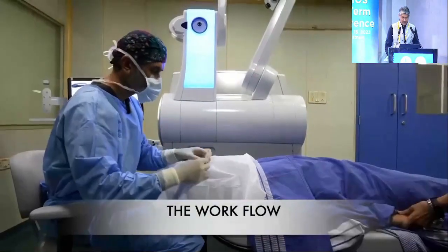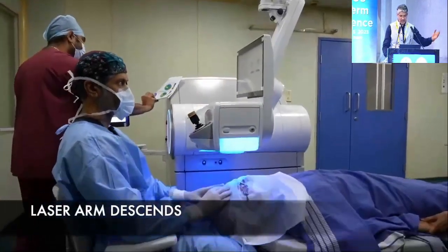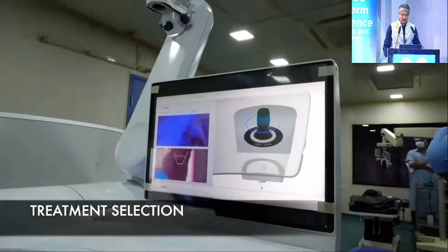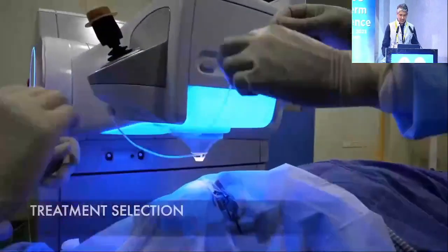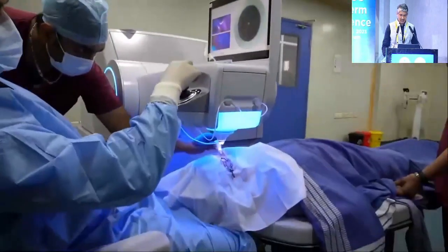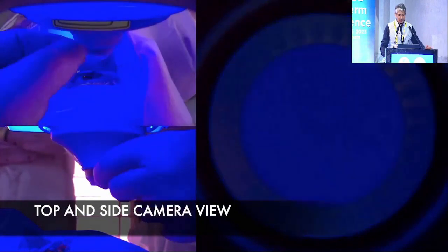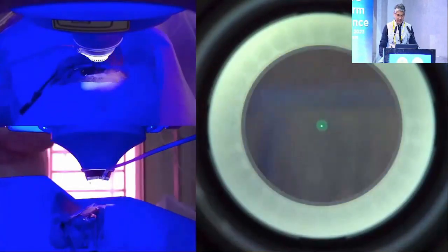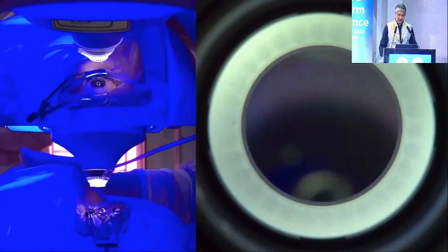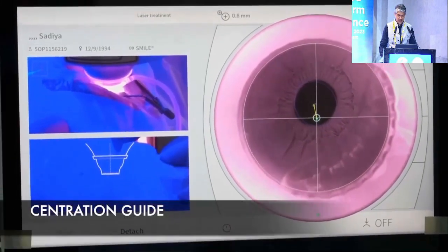So if you look at the workflow of the Visumax 800 and how it is different from the 500, you have a laser arm that descends, you select the treatment, and then here that is attaching the PI, and here instead of the bed moving up like the 500, the laser arm moves. It also has a top and side camera view so that you can actually adjust the PI onto the patient's cornea by looking at the cameras.